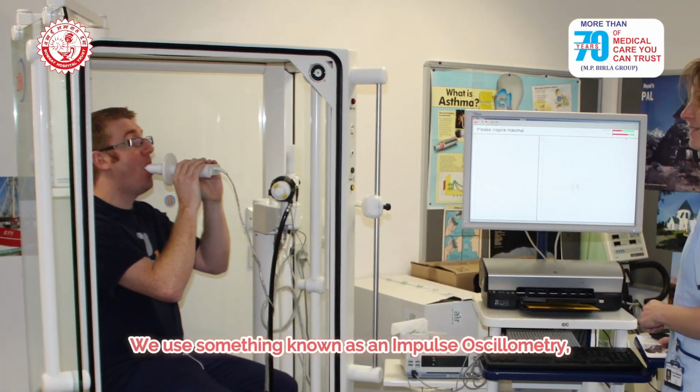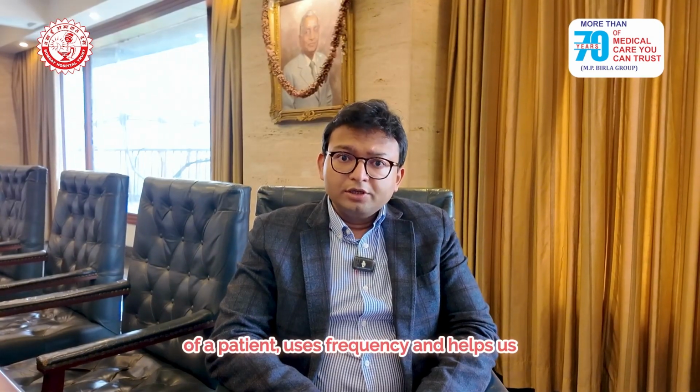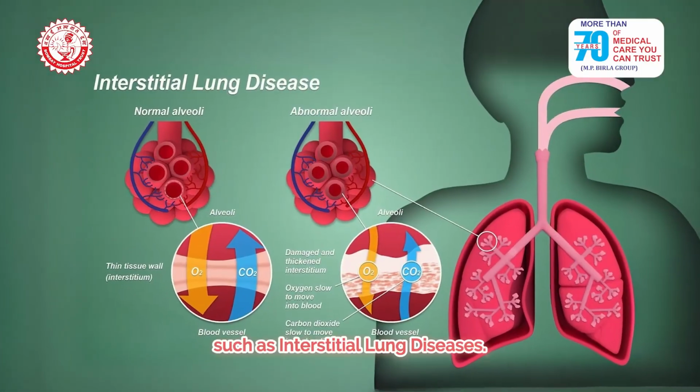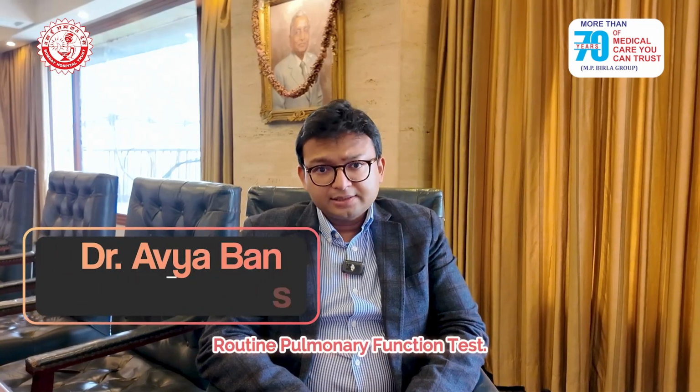We use something known as an impulse oscillometry, which measures the tidal volume of a patient, uses frequency, and helps us understand whether it's an obstructive disease such as asthma, COPD, or a restrictive lung disease such as interstitial lung diseases. The IOS can be performed in patients who are scared, apprehensive, or unable to hold their breaths and exhale at a speed which is demanded by a routine pulmonary function test.